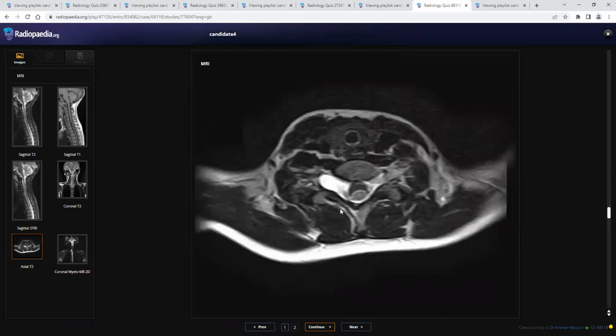So my primary diagnosis is lateral thoracic meningocele. I would like to rule out other features of NF1 in this patient, maybe in the brain or elsewhere systemically. There are no features of NF1. And what do you do next? How do you manage? I will refer the patient to a neurology team, and I would like to do genetic screening of this patient for NF1. Why genetic screening?